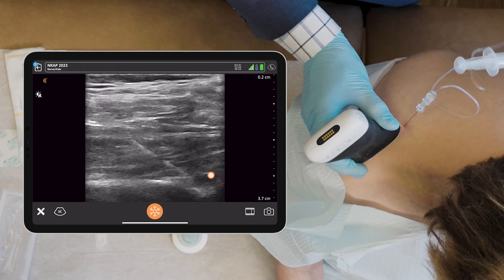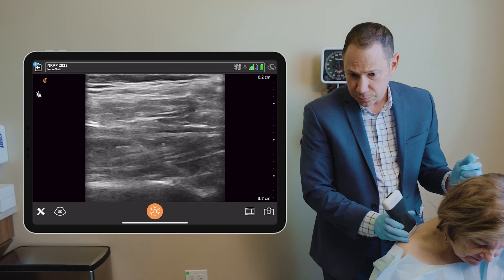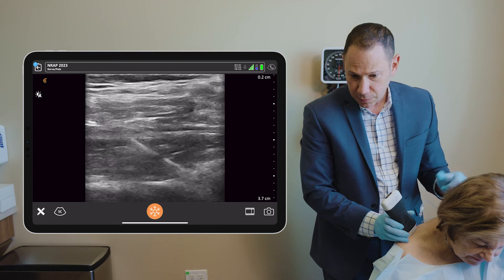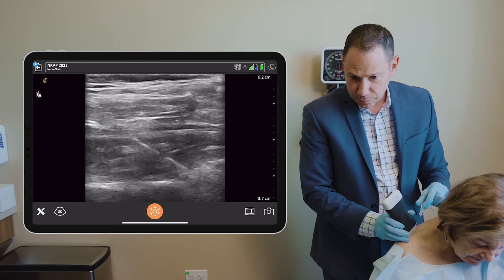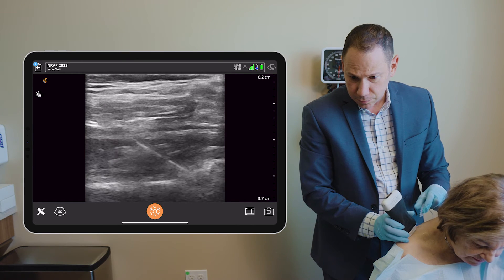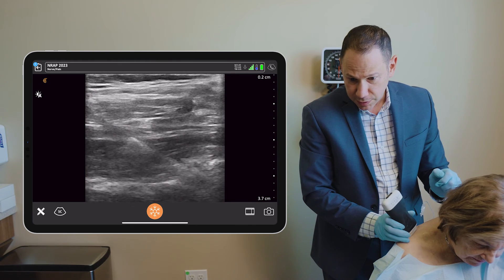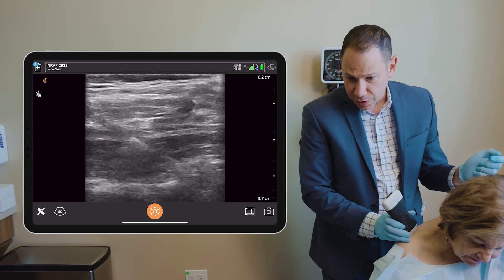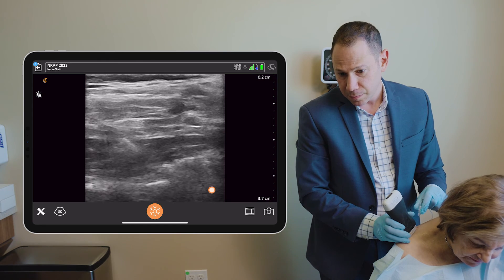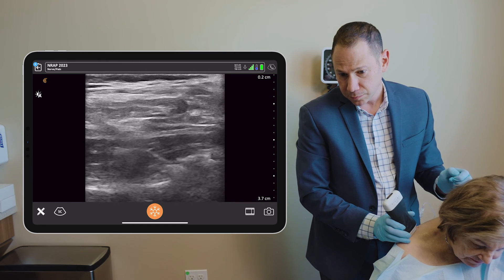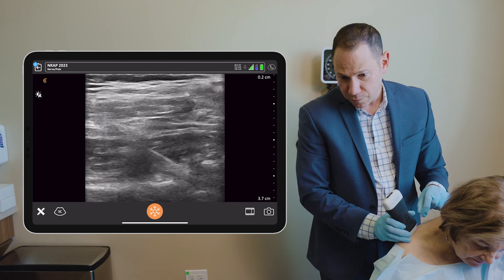I just broke through the ligament. I'm going to aspirate and inject. A little air went in, and we lose visualization of the nerve once the air goes in unfortunately. But you can at least see that the needle is placed right at the transverse scapular ligament, and there is spread under the ligament as well. I'm going to remove the needle and we're done.